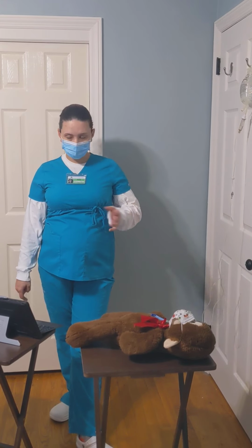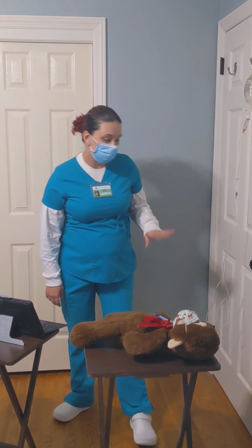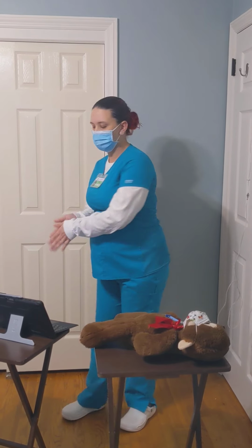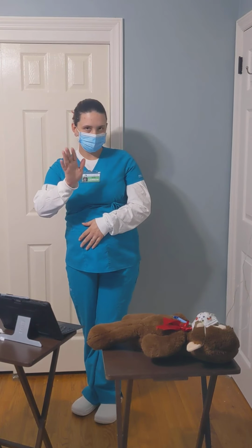I'm going to monitor the patient for any signs, symptoms of an adverse reaction, and also periodically monitor their IV site for any signs of infiltration. And I'm going to take my gloves off, wash my hands. All right, Mrs. Nagel, I'll check on you in a little bit.